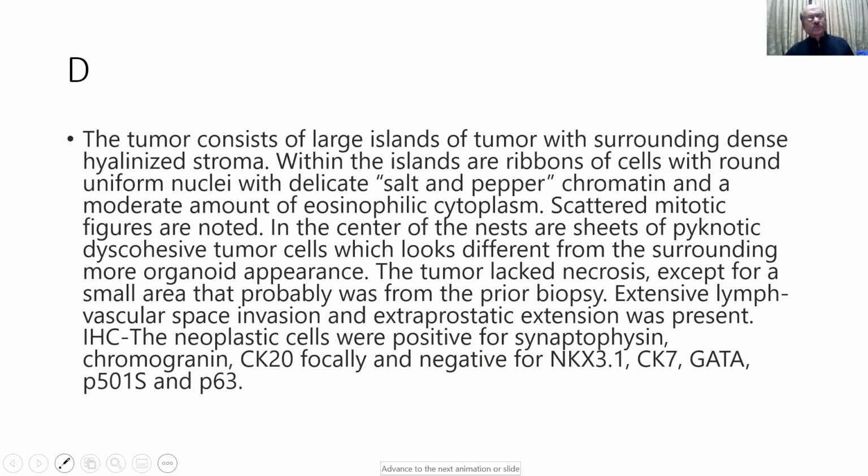So the diagnosis is carcinoid tumor. Carcinoid tumor in the prostate is very rare, but it happens.